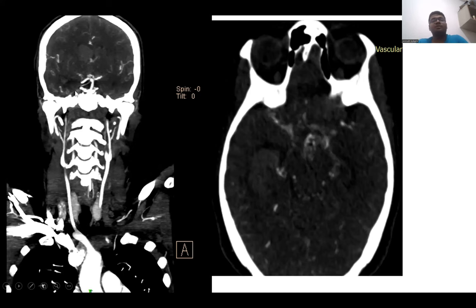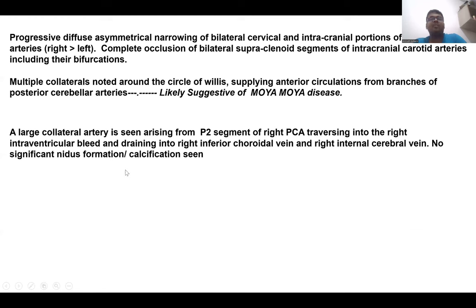In the case of bilateral intraventricular hemorrhage in the lateral ventricle, the cause was found to be moyamoya disease. There is narrowing of the internal carotid artery with complete occlusion of the supraclinoid portion of the internal carotid artery, and multiple collaterals are seen. Multiple collaterals are noted around the circle of Willis, supplying the anterior circulation from branches of the posterior cerebral arteries, suggestive of moyamoya disease.